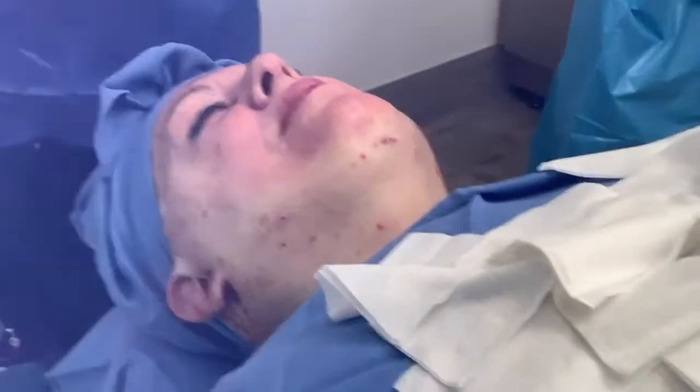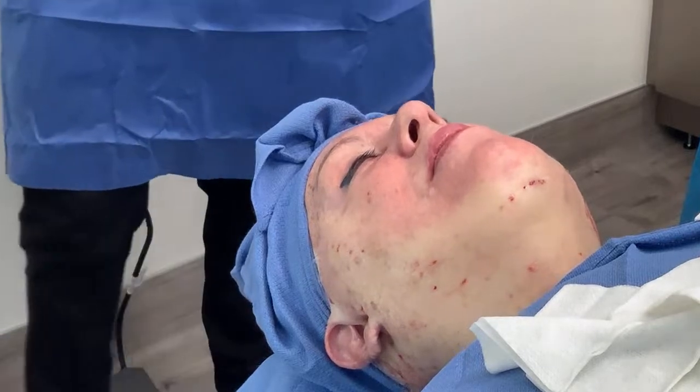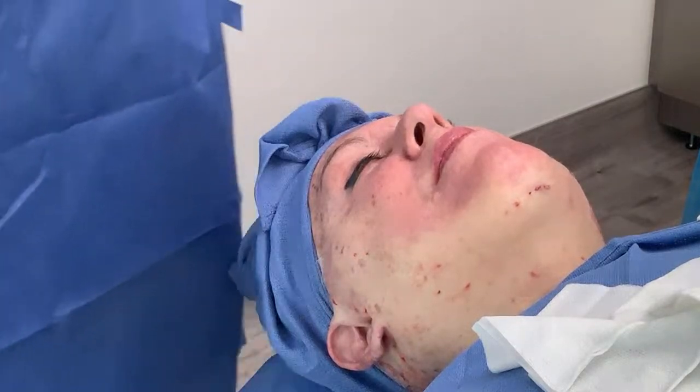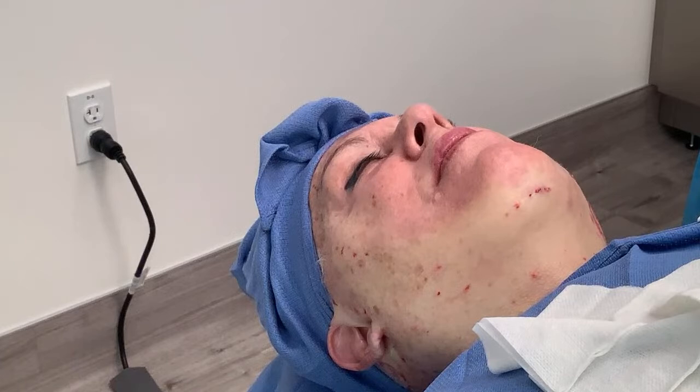So now what I'm going to do is we start out with our laser lipolysis. So this is a local anesthesia facelift. I am a double board certified facial, plastic, and reconstructive surgeon. And a lot of people are unaware that we can do this under local anesthesia.